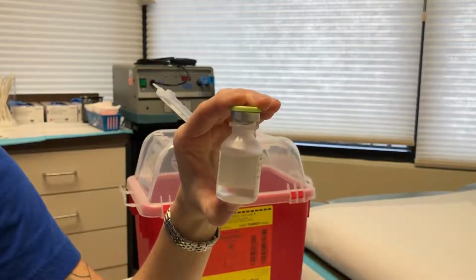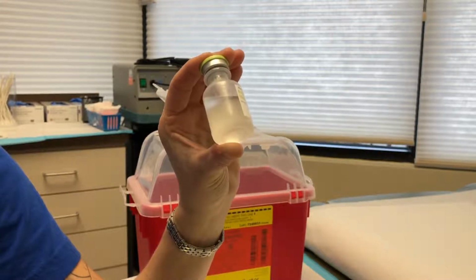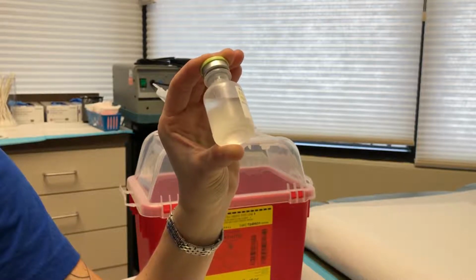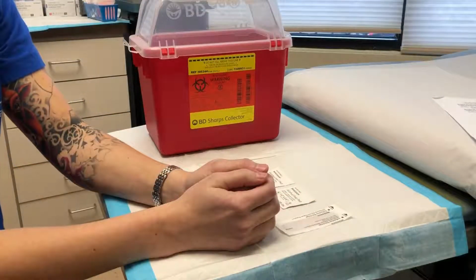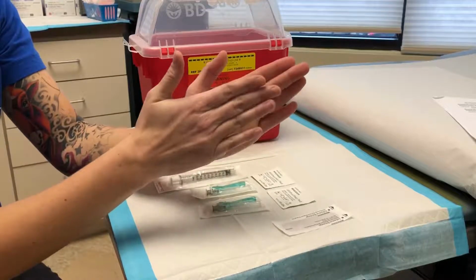Before you draw up your medication, hold your vial up to the light to check for floaters or other contaminants in the vial. If your medication looks contaminated, do not use it and contact the pharmacy. Keep the medication in case the pharmacy asks you to return it. The hormone is suspended in oil, which can be a bit more uncomfortable to inject, so before performing your injection, roll the vial in your hands to warm up the medication.